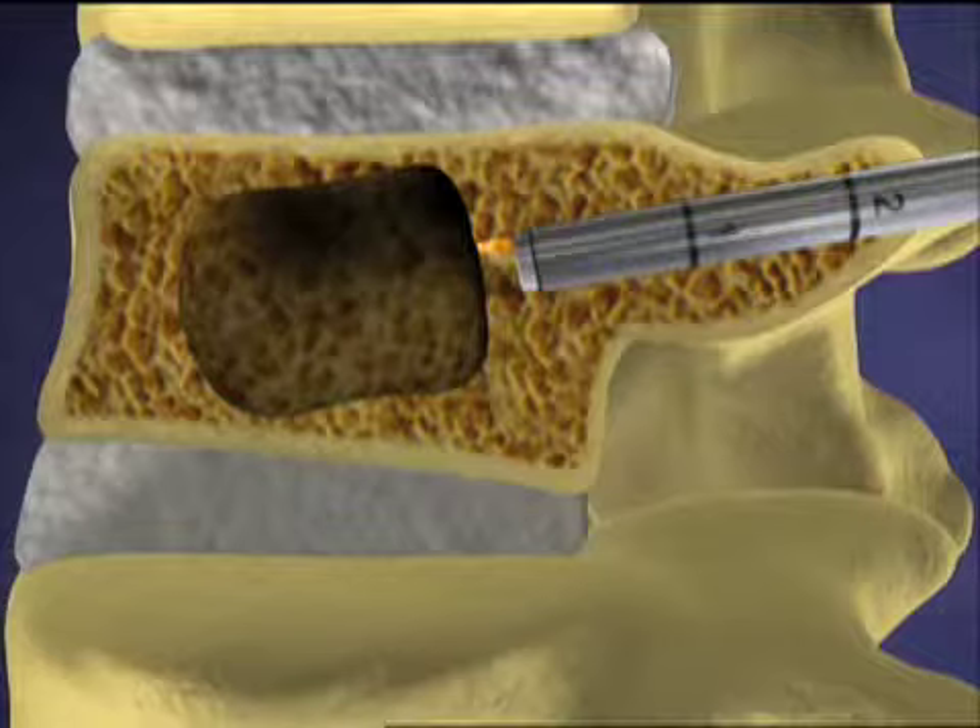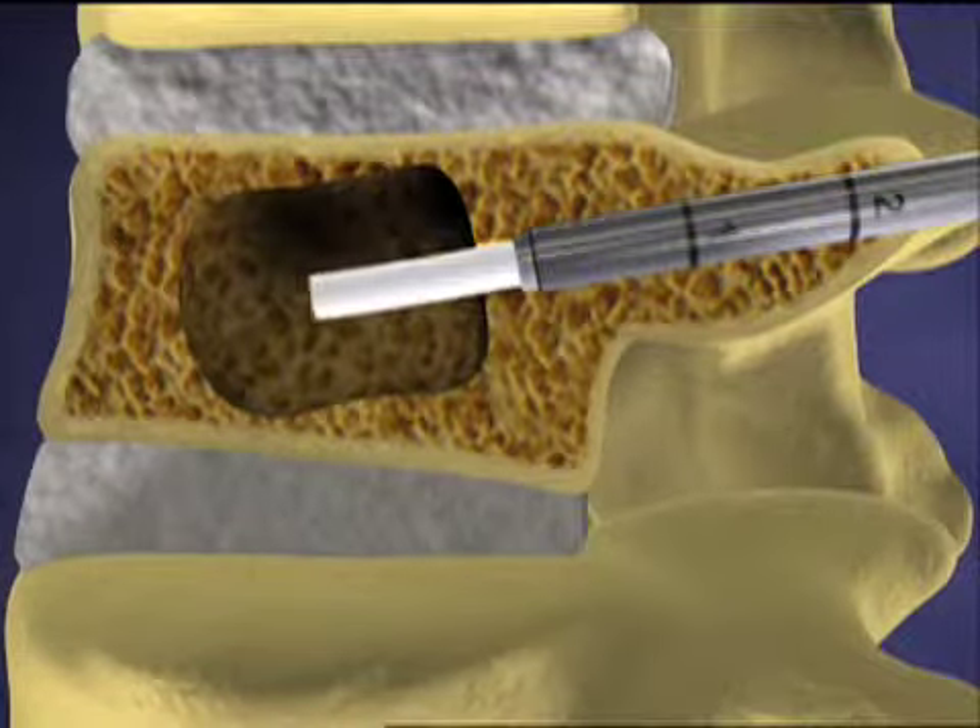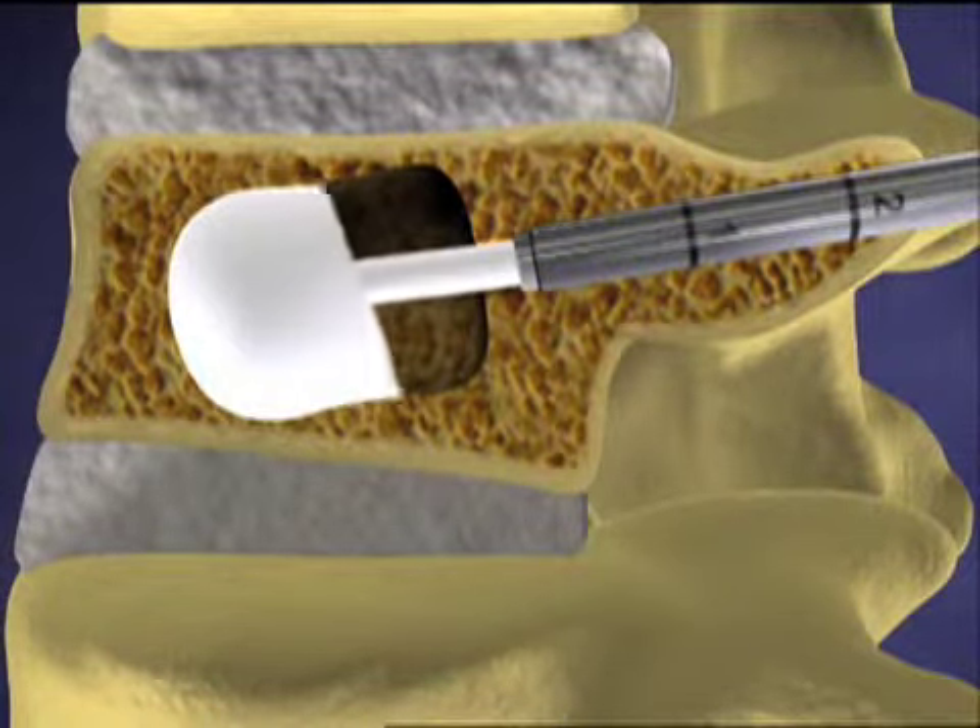and the cavities left by the balloons are filled with bone cement to create an internal cast and stabilize the fracture.